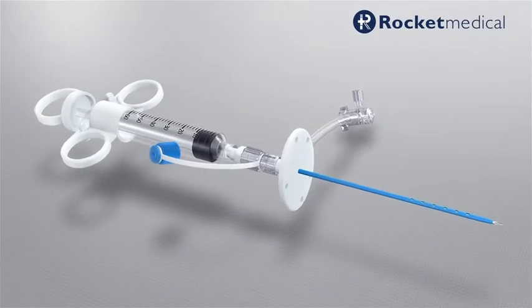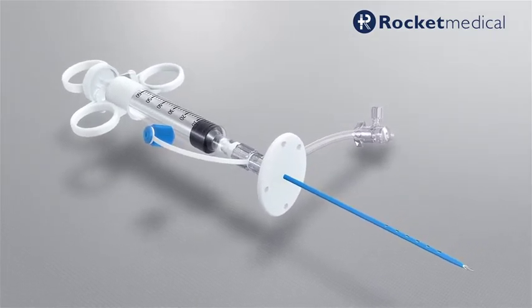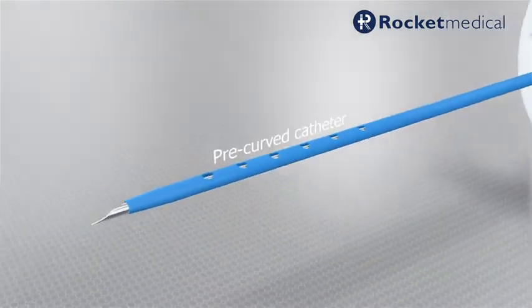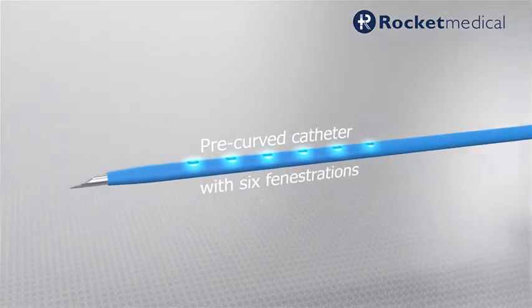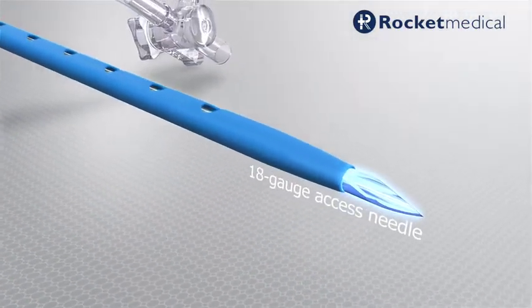The Rocket Medical 6 French Gauge Thoracentesis catheter has been designed for the percutaneous aspiration of pleural effusion. A pre-curved catheter with 6 fenestrations and 1 cm depth indicators is mounted onto an 18 gauge access needle.